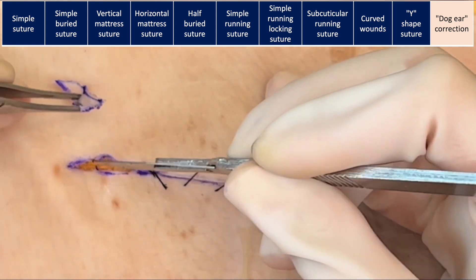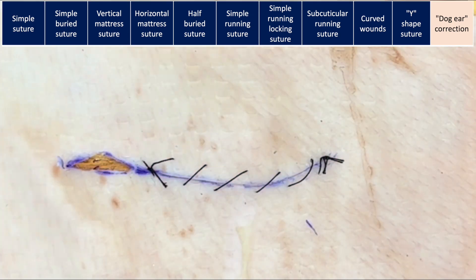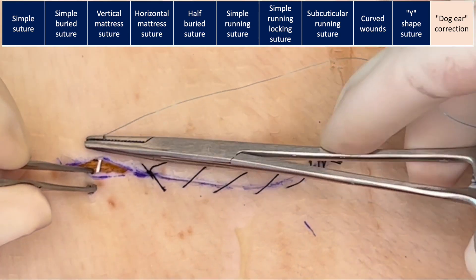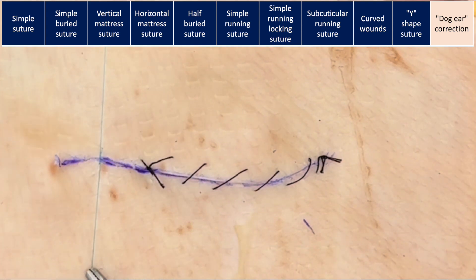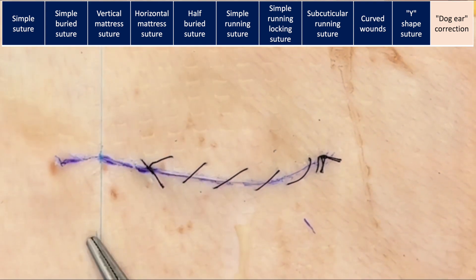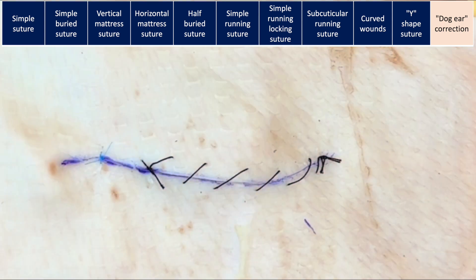We bring together the new defect using sutures. Sometimes, when we want to minimize the length of the resulting scar, we can descend as little as possible and then attempt to align the two lengths of each edge with sutures, as we saw in the example of curved wounds.